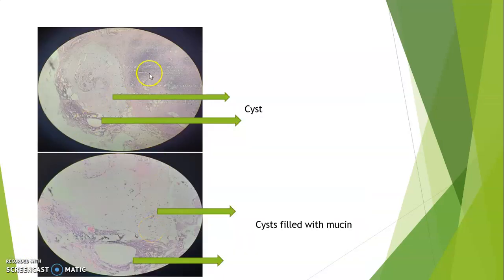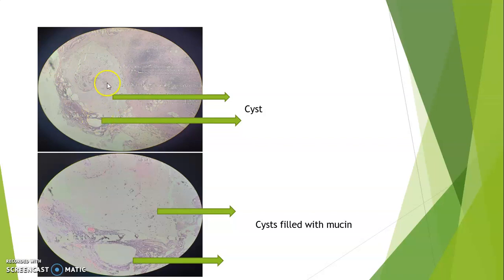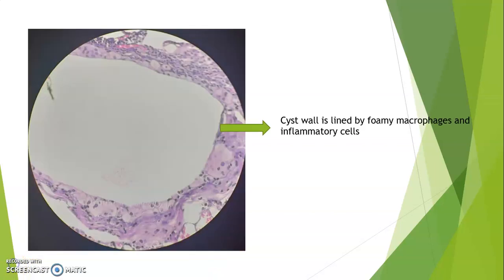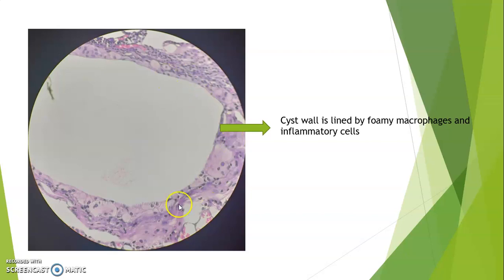These microphotographs show a low-power view of the appendix wall. On the serosal surface, two cysts are visible — one larger, one smaller — representing mucus retention cysts. The cysts are filled with mucin and some inflammatory cells. The higher-power view of the cyst wall shows it is lined by macrophages and chronic inflammatory infiltrate, indicating the mucosal lining has been completely effaced or destroyed by the mucin.